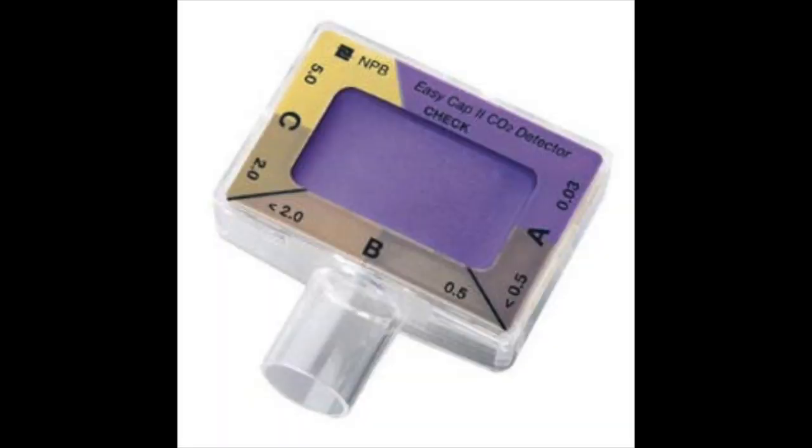Let me put this up. This is a colorimetric device. Basically, it's just a piece of litmus paper inside of this little plastic container. After your patient is intubated, you slide this onto the top of the ET tube, and there's another area that you can't see that you bag into. So you bag into one end, and the other end is connected to the ET tube, and the patient's exhaled CO2 is going to change that litmus paper, hopefully, to the color yellow. Yellow meaning yes, you're in the right spot. If it stays purple or gray, you're probably not at the right spot. That patient needs to be extubated. Because if that patient is being ventilated through that tube and into the belly, your patient's going to die because you're providing them no oxygen whatsoever. And a lot of people have succumbed to this over the years.